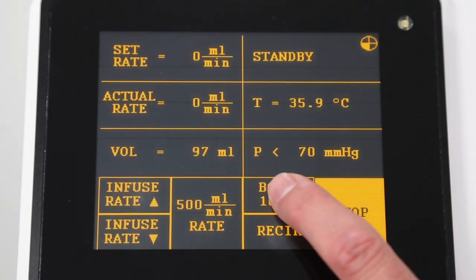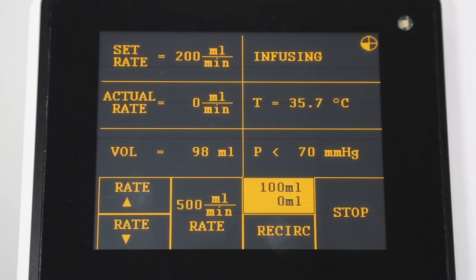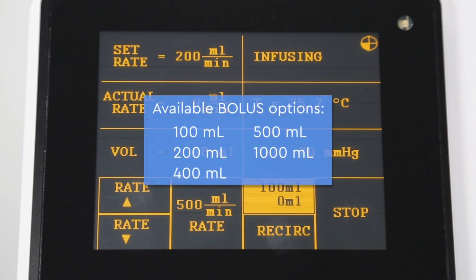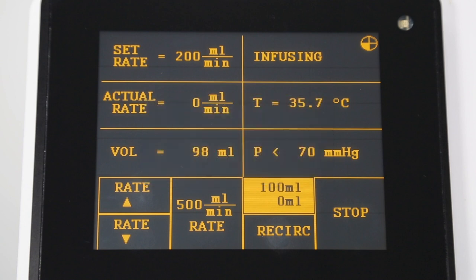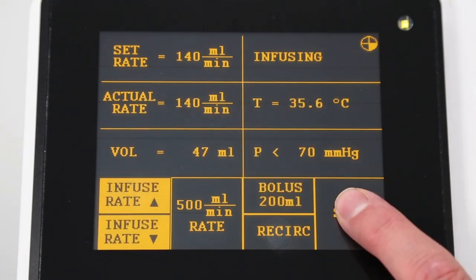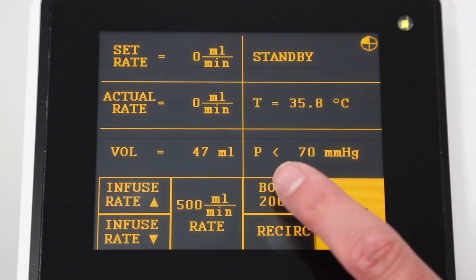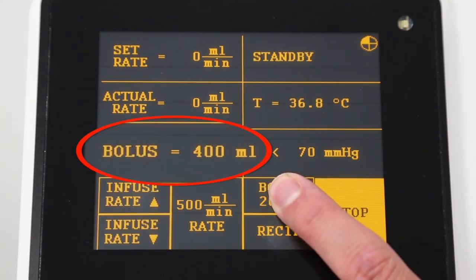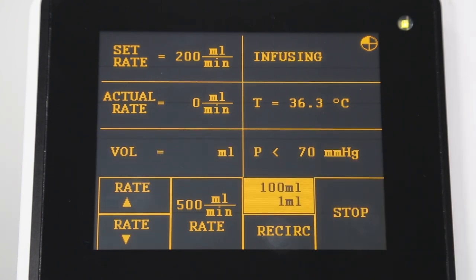Pressing the bolus key will deliver a specific volume of fluid. The volume delivered will be displayed on the lower half of the bolus key until the bolus operation is complete. Available bolus options are 100, 200, 400, 500 and 1000. To change the bolus settings, press stop and then press and hold the bolus key to scroll through the different values. When the desired bolus volume is displayed, simply release the bolus key.